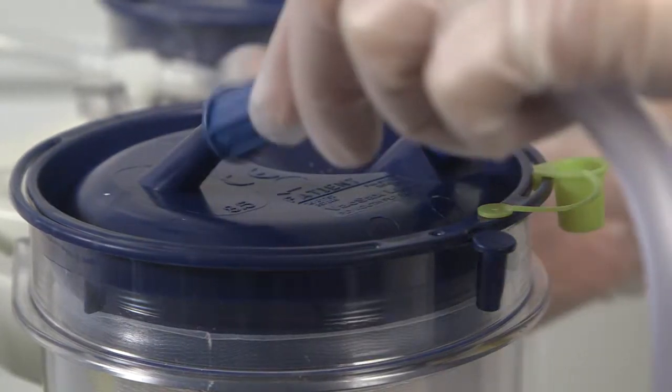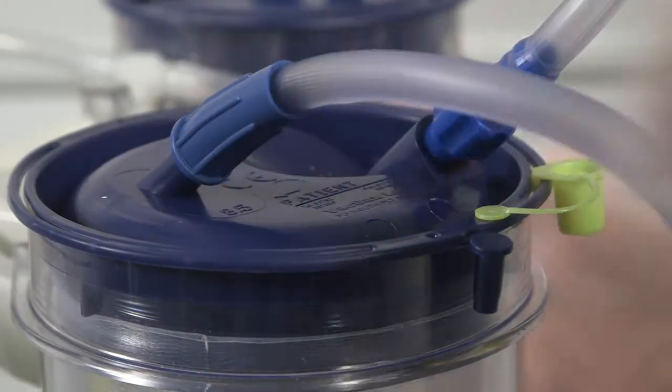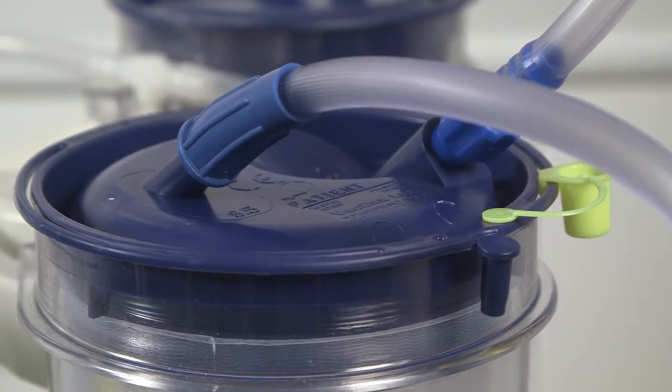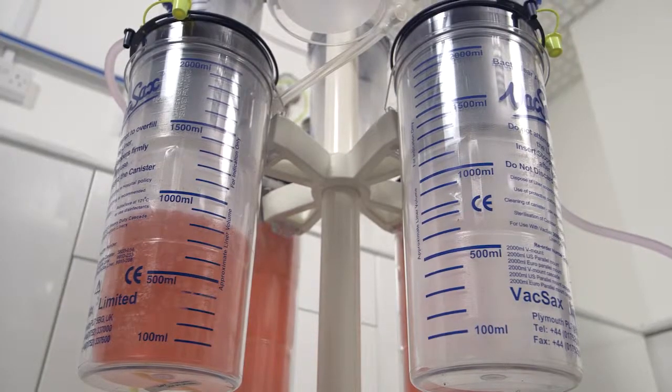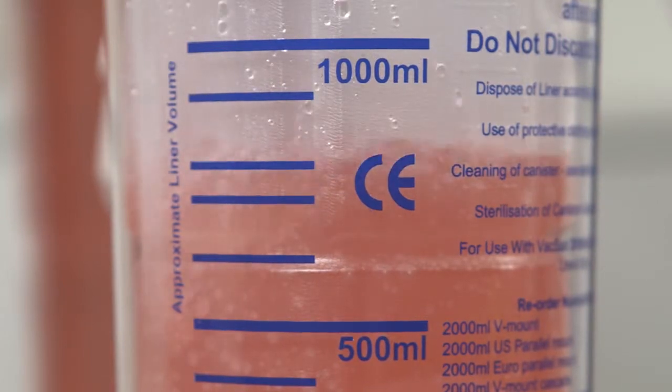Now connect the patient tubing to the first blue cascade liner mounted on the bottom row. The system is now ready for use and will commence to fill and cascade.